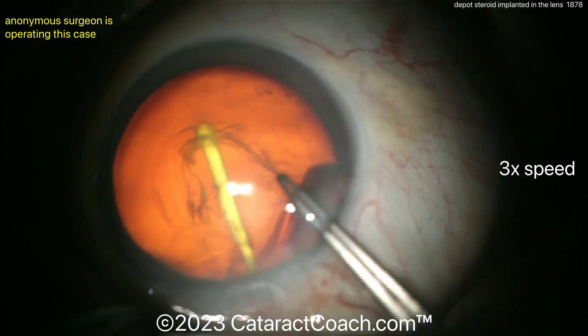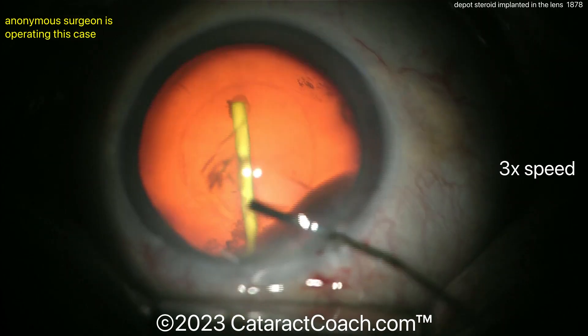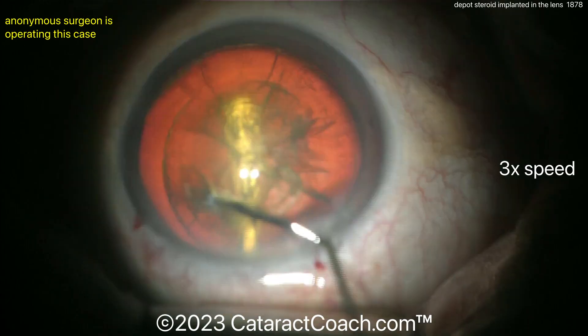After getting the capsulorhexis done, the first thing I would do is pick up that implant, pull it up out of the lens, bring it into the anterior chamber, and explant it. That makes the most sense — I just don't want it to fall back into the vitreous cavity.